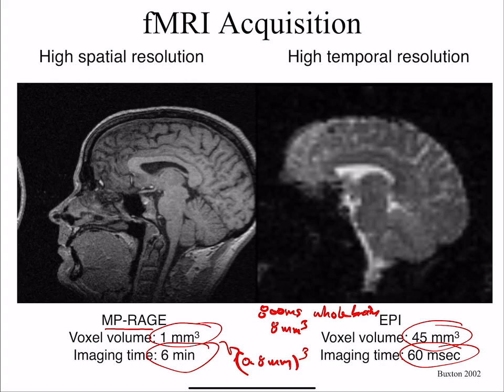Yeah, there's been some work with machine learning and whatnot. No, that is being done, and we'll talk about that on Monday. In fact, the vendors are rapidly coming out with deep learning recon, which basically means that everything you've learned you don't really need to know. Just let the computer do it. So yes, that is being done. The tricky thing is, with deep learning, you're never sure when it's going to fail.